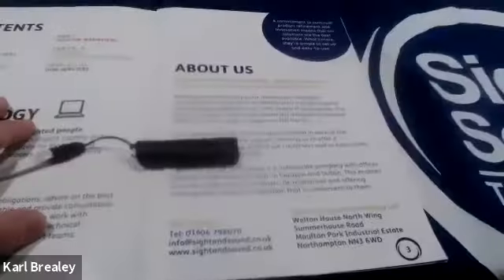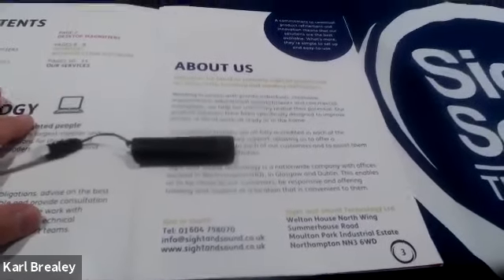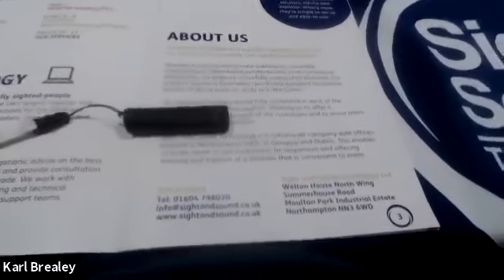And the glasses is still the same one or different one, smaller, and to be fair, it comes with multiple connections anyway. So even if you've got dark glasses you have to wear out and about, we can find a way to fit them.